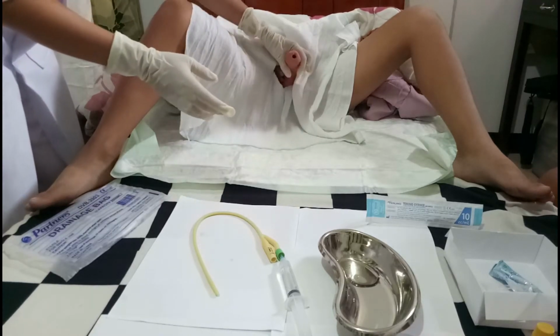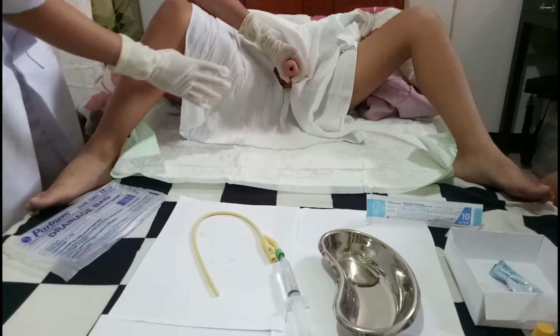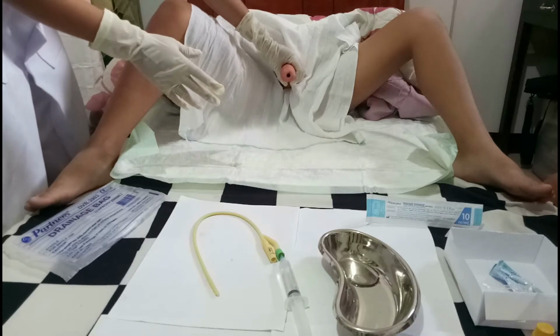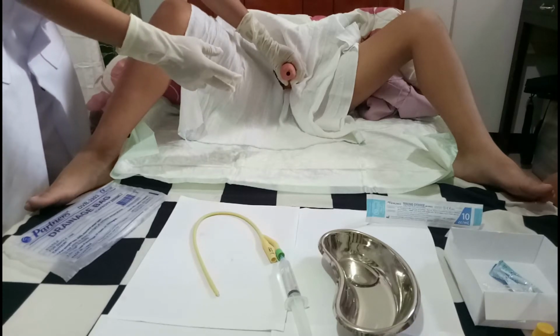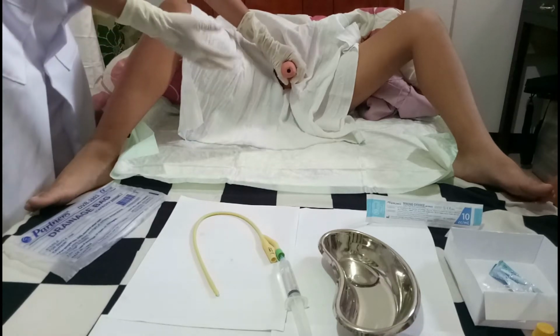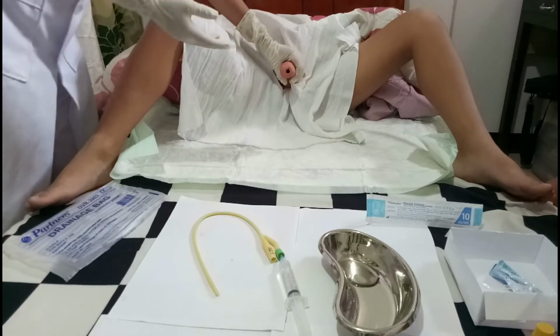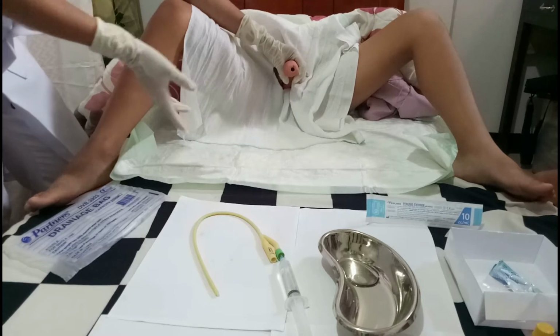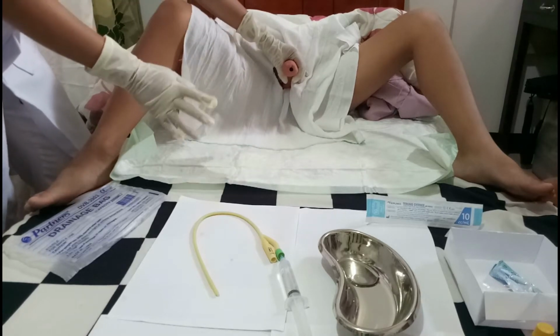So, at this point, I'm going to hold on like this and raise the penis at a 45-degree angle from the scrotum. And if he is not circumcised, I'm going to retract the foreskin, but in this case the patient is circumcised, so no need to retract the foreskin.